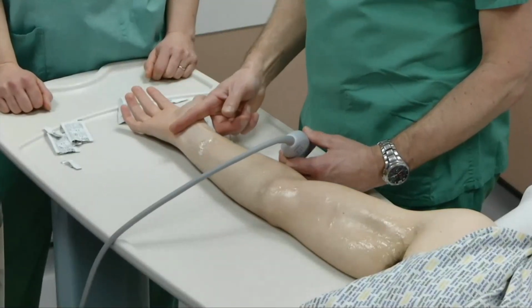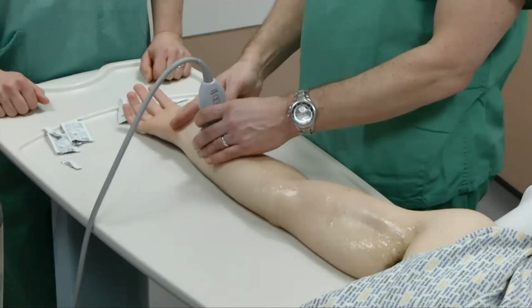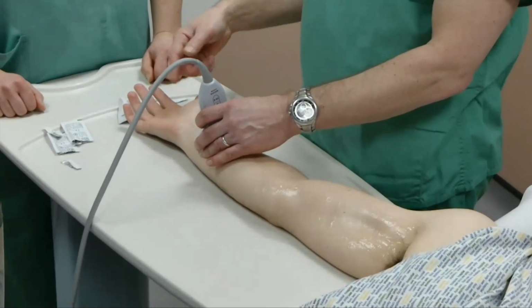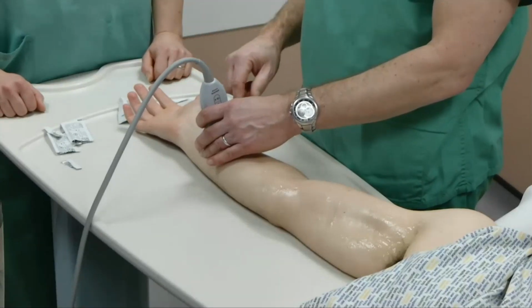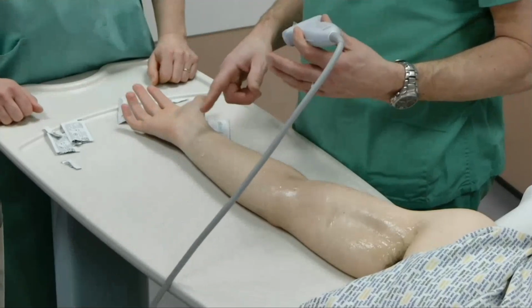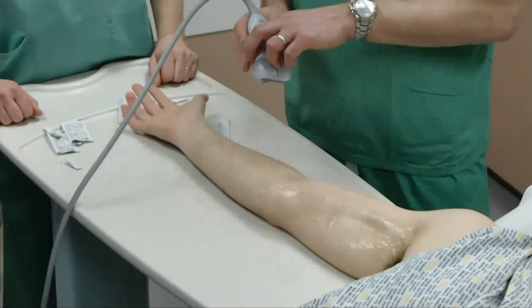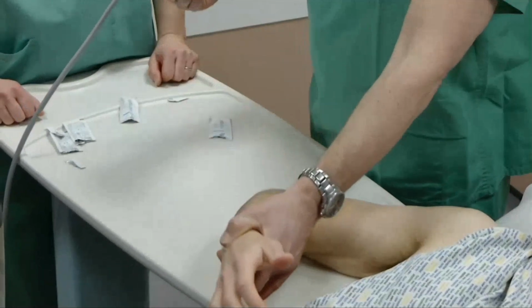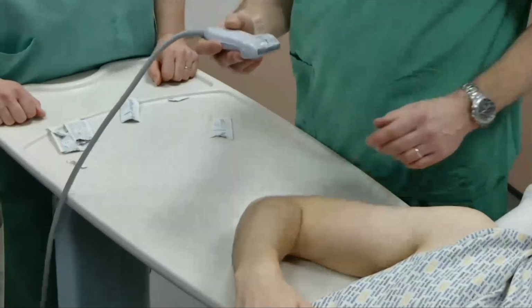Okay, and so distal block here would be for something like a Dupuytren's or hand surgery, ORIFs, that sort of thing. Okay, so just as the median nerve has two places, the radial nerve does too, and so we're going to just flex Sam's arm up like this across his chest.